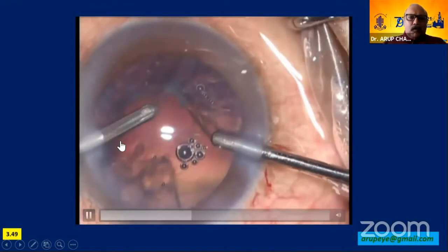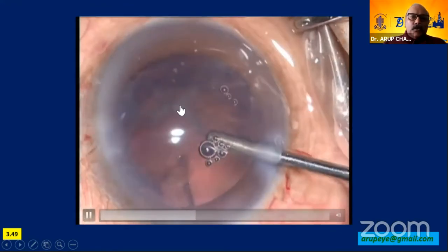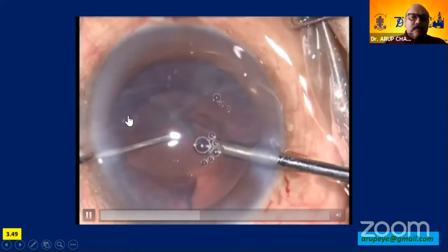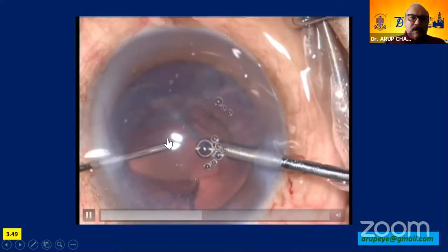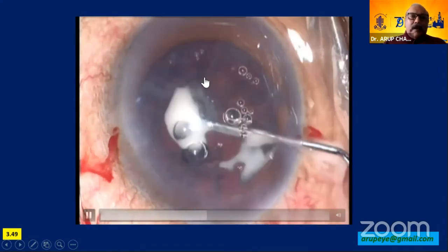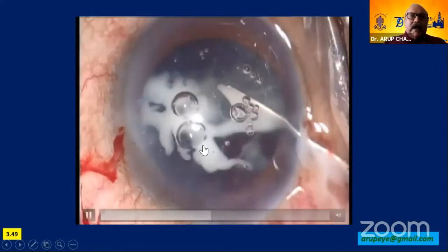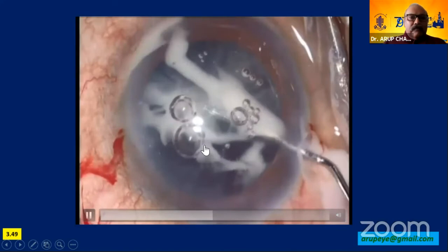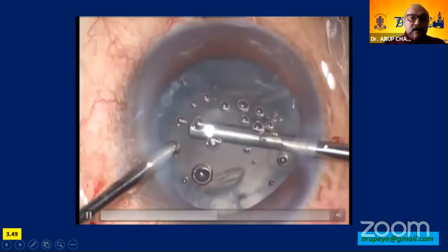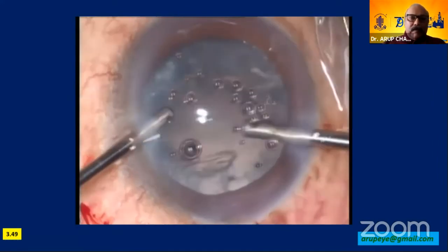the cortex is taken out. But here again, the mistake number 2 was irrigation was placed very close to where the PC dent was present. That should not have been done. I should have removed the cortex away from the posterior capsular rim, and after that access the area of capsular bag to remove the cortex at a later stage. And I should have used a Visco shield strategy to plug the central hole so that the anterior vitreous face would not have got broken, and I would not have had the vitreous present.